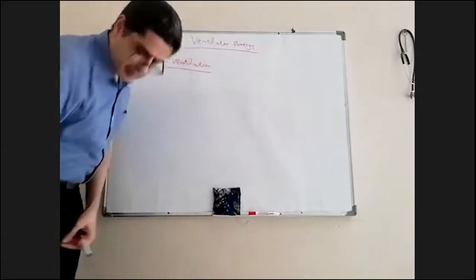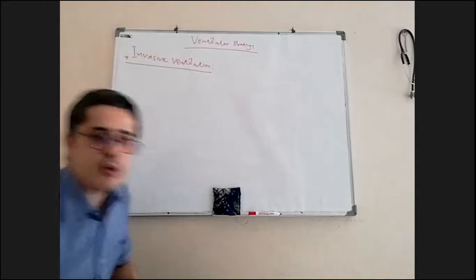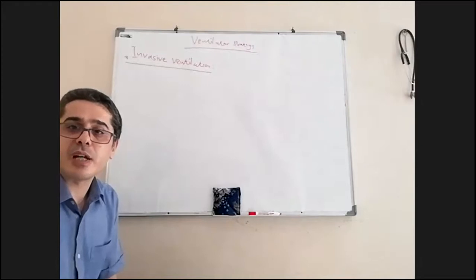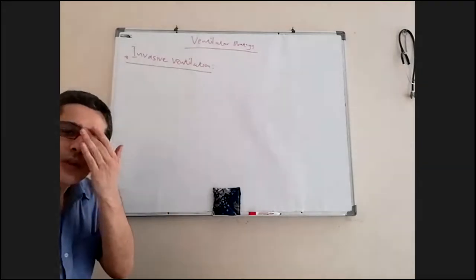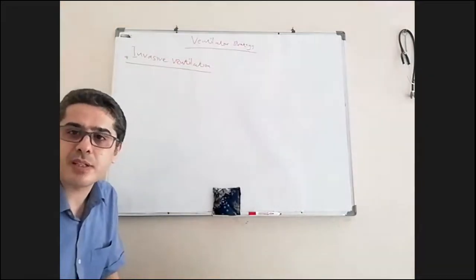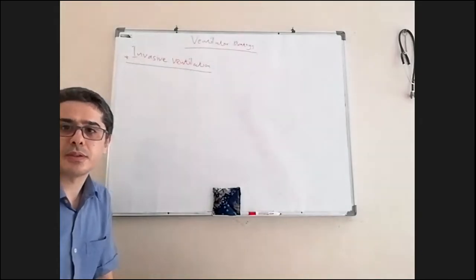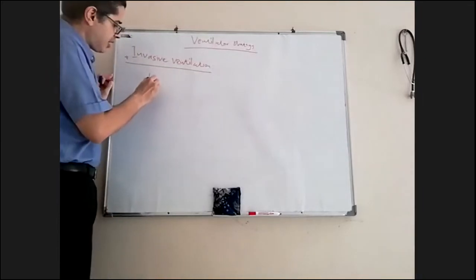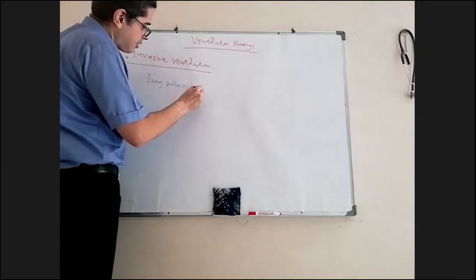So now, which strategy will you use in this case, RDS? Will you use the restrictive strategy or the obstructive strategy regarding the parameters? Anyone answer? Do you think lung protective strategy is good for RDS? Yes, you can use lung protective strategy.